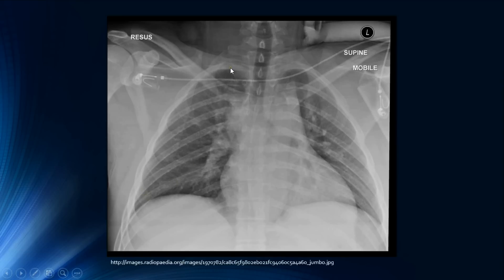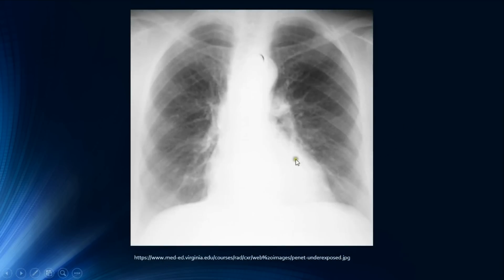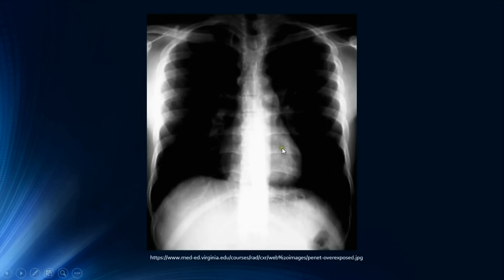Counting the ribs — one, two, three, four, five, six — the sixth is far away from the midline of the diaphragm, so this is an inadequately inspired chest radiograph. That explains the apparent interstitial infiltrates in the lung fields, which are actually false. We also see an example of under-penetration, where the vertebral column behind the heart is not visible, and an example of over-penetration, where the vertebral column is easily visible and the lung fields are too black with lost bronchovascular markings.